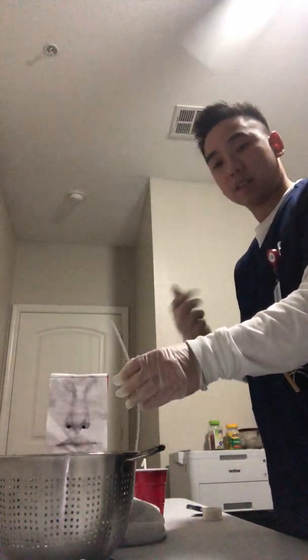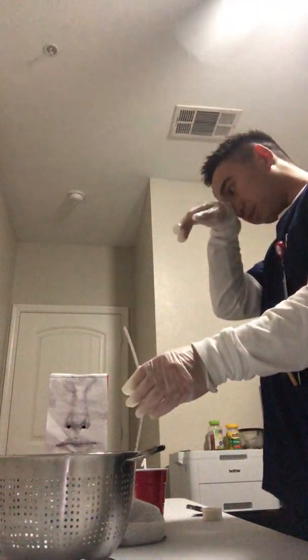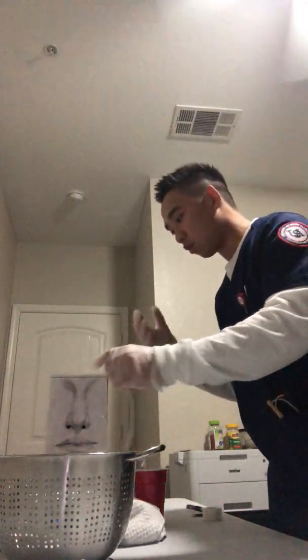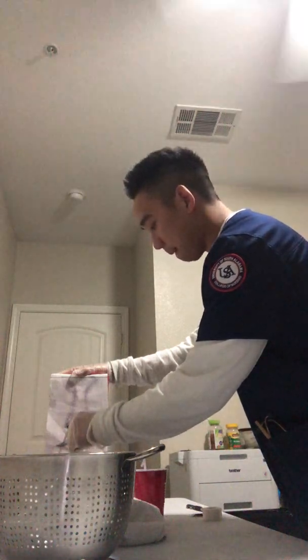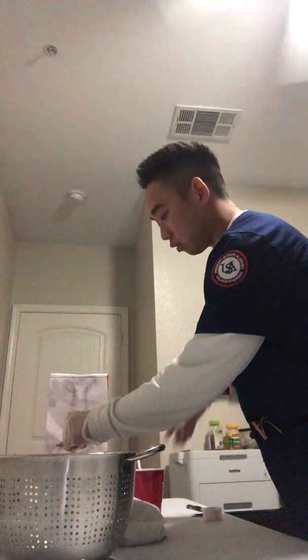So as you're inserting, it's important not to force against any resistance. You're going to want to put it in the more patent nare. For my patient, it's going to be the right. I also have his water right here. He's going to be taking sips while I'm inserting.